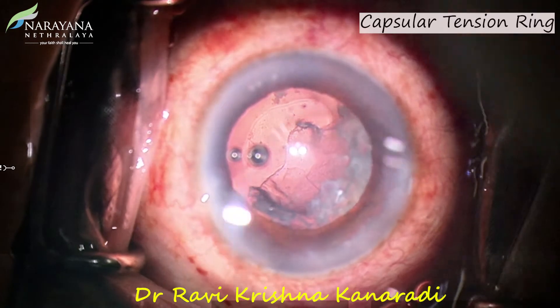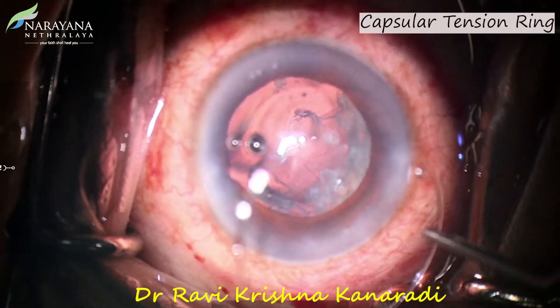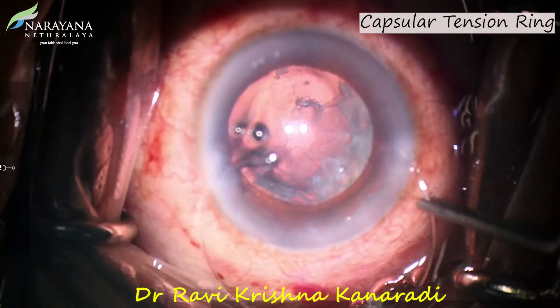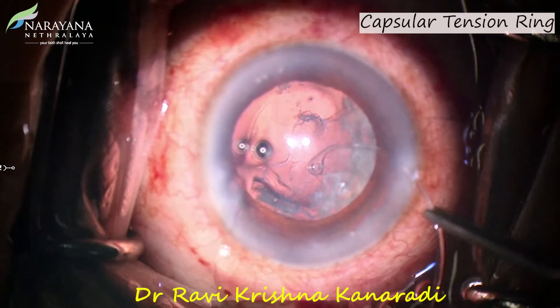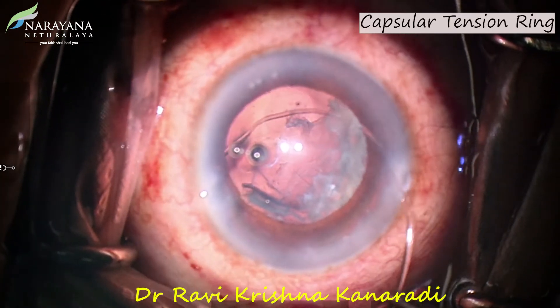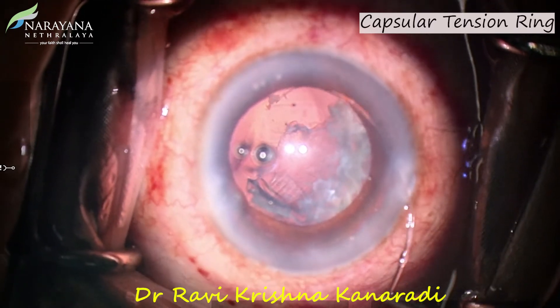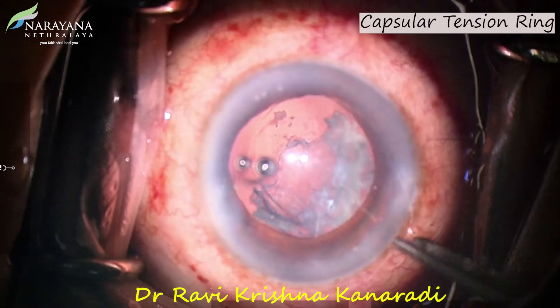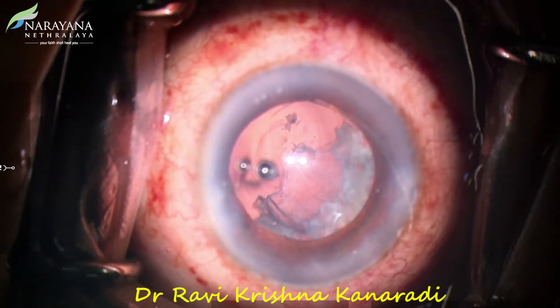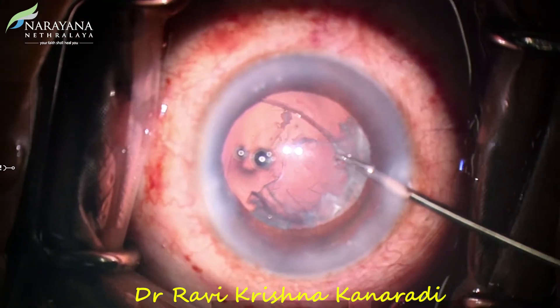I decided to use a capsular tension ring (CTR) at this stage to stabilize the bag. Since the area of dialysis is between 4 to 9 o'clock position, I introduced the CTR gently into the bag opposite to that, through the side port using a lens holding forceps, and progressively pushed it in. The CTR is seen traversing the region of zonular dialysis. Once the other end of the CTR comes near the side port, I use a capsule access forceps to hold the tip and gently release it inside the bag.